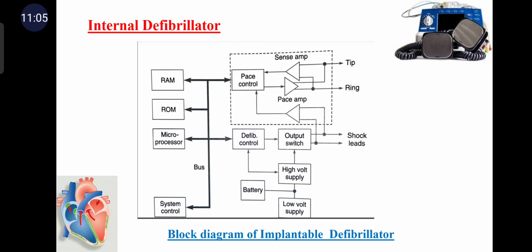If the signal being sensed drops suddenly in amplitude, which is common during fibrillation, the automatic gain control circuit in this amplifier increases its gain so that the fibrillation signal continues to use the system dynamic range. A dynamic threshold circuit may then be used to sense the R waves for fibrillation. This sensing circuit is active throughout the entire life of the implantable defibrillator, so minimizing the power consumption of these circuits has a beneficial impact on the device's lifetime.